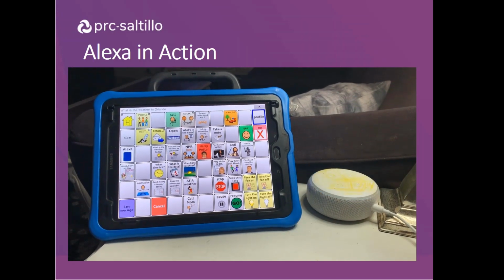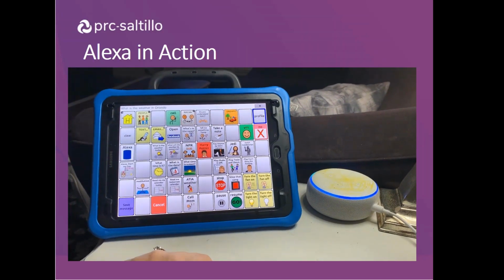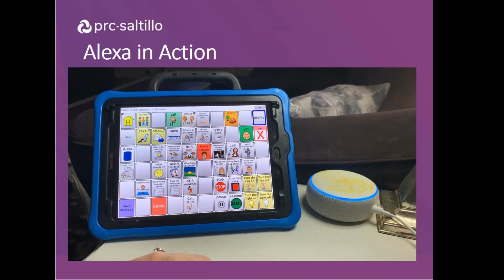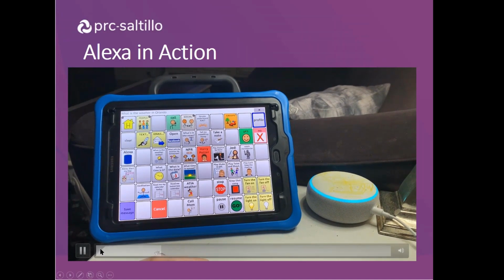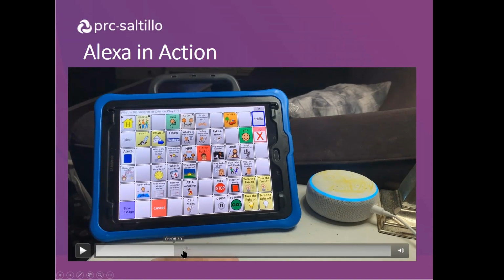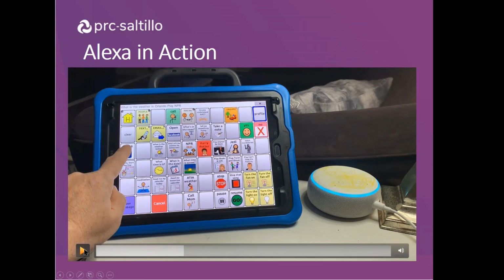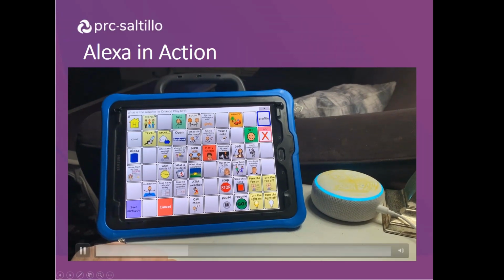Alexa, what's in the news? Where should I get your news from? You can say something like CNN, Fox News, NPR, or CNBC. So pause. So Alexa, you can choose your news source. Have Alexa read the news. Now, I'll play international news. You can add local news at any time. Just ask to select.